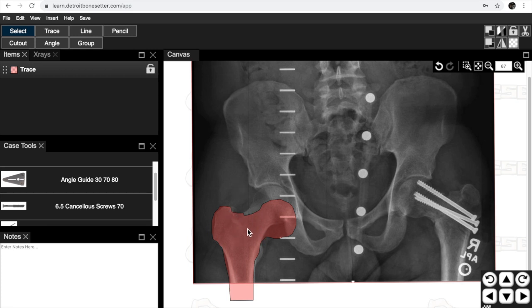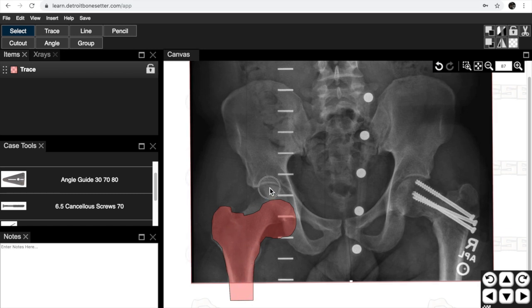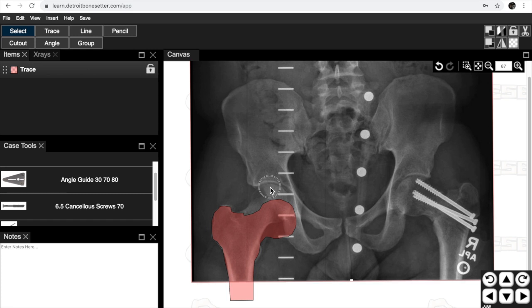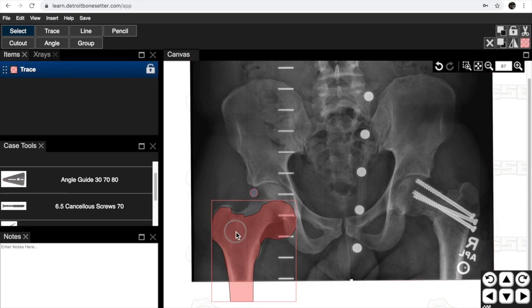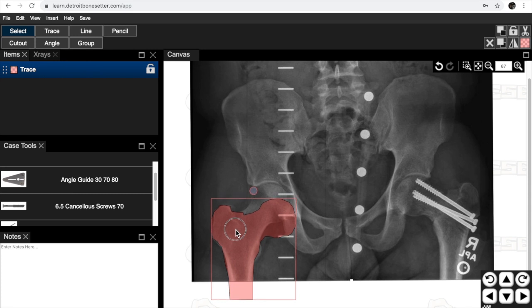Now one of the things that we have to remind you about is the fracture is at the neck. So the greater trochanter, lesser trochanter, and the shaft is identical. There's no deformity. If we line up the greater trochanter on both of these, the right and left side, then we know that we can actually measure the broken side.